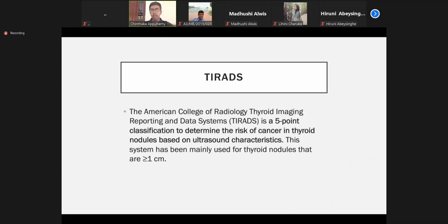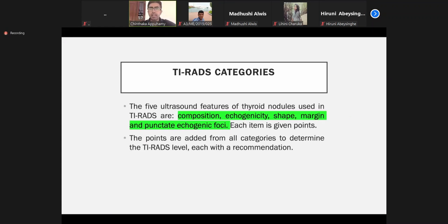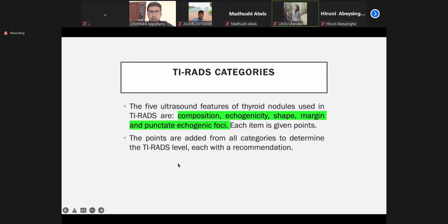Like BIRADS for breast, for thyroid we have the TIRADS classification. According to the composition, echogenicity, shape, margin, and calcifications, we get scores. When I say it's a TIRADS 2, there is less than a 5% chance of malignancy. So usually we don't do a biopsy. But for TIRADS 4 or 5, we always go for cytological evaluation.